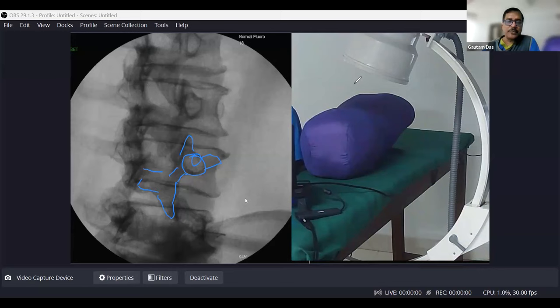You can see the recorded lectures later on as well. Okay, so what I was trying to tell, the Scottish dog. So this is the body of the Scottish dog. This is the hind leg of the Scottish dog. And this is the tail of the Scottish dog. So this is a nice Scottish dog.